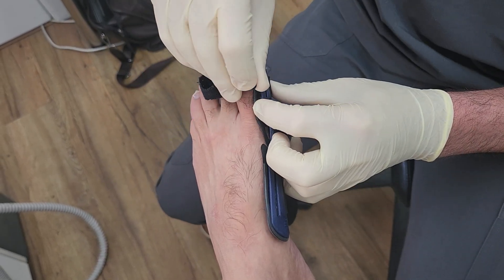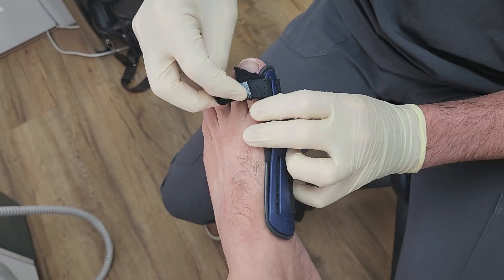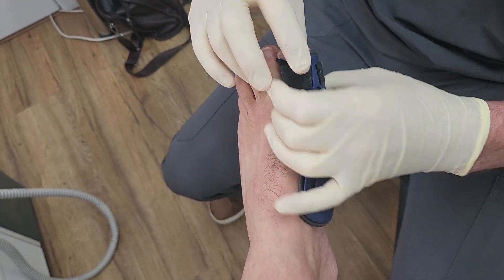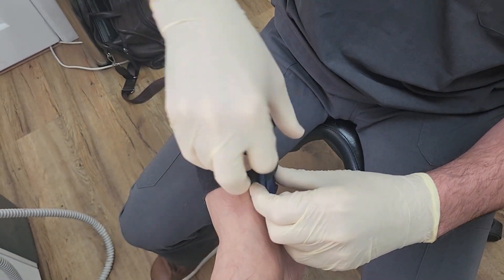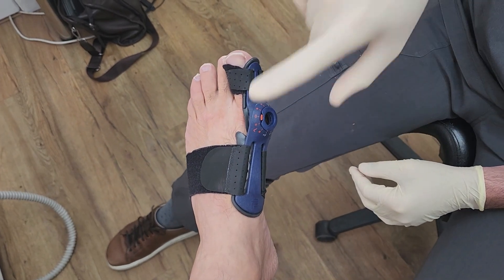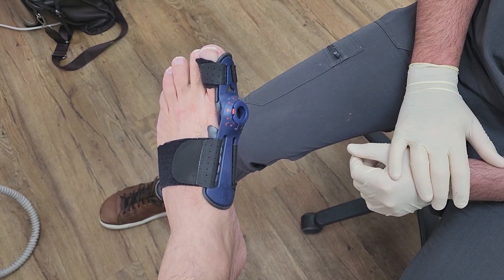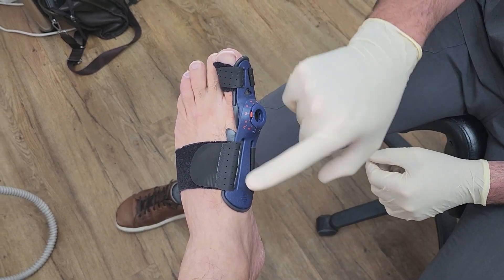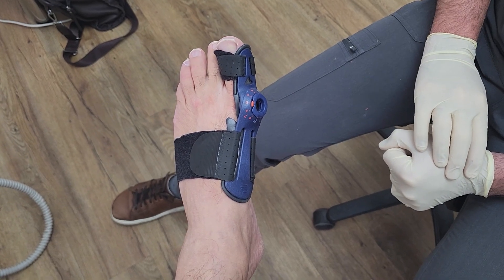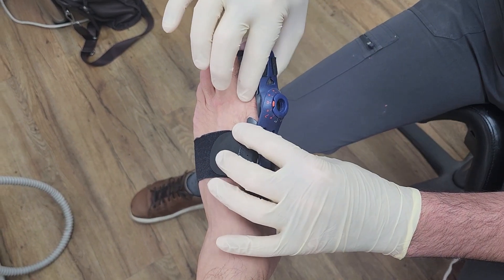The splint has worked in relieving symptoms. By how much do you think it's relieved symptoms? It's basically like a 9 out of 10 in pain relief. I wanted to video this because everything else failed to relieve symptoms, and then two weeks of using this splint has pretty much taken the pain away by 90%, which is quite significant. I was going to review the patient after about six weeks, but I ended up reviewing him after two weeks and was quite taken back by how much pain relief we'd had. So I'm going to start using this splint for hallux limitus and hallux rigidus applications — anyone who has big toe joint pain or arthrosis in the joint. It's just a fantastic splint in limiting range of motion.